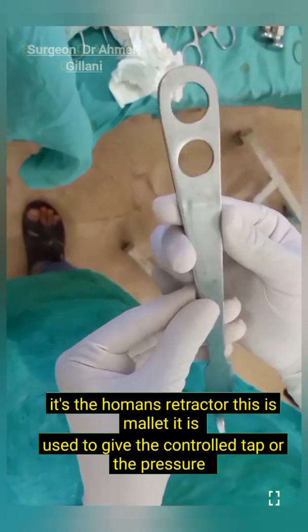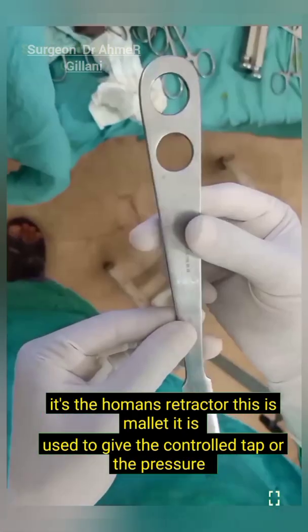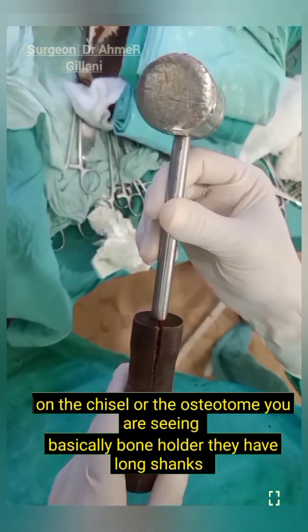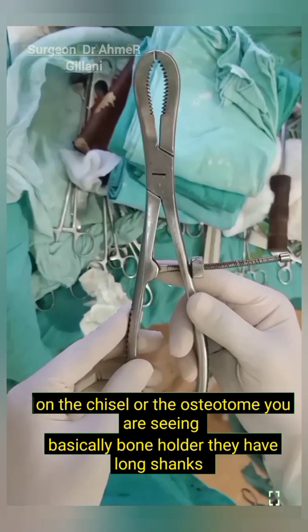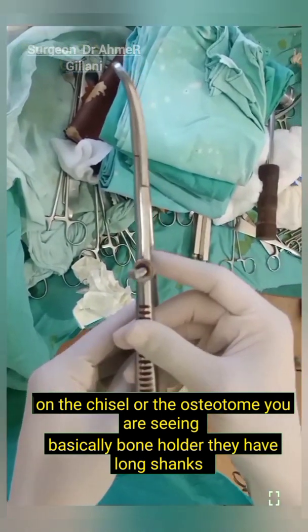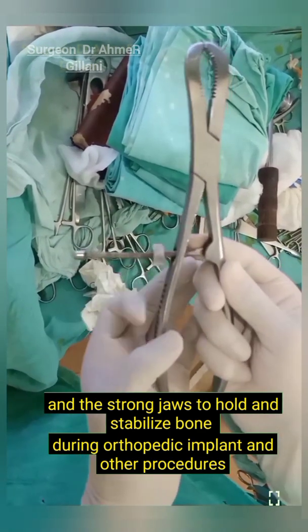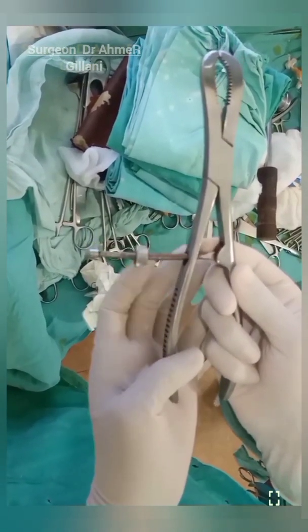This is the most commonly used instrument in orthopedics — the Homans retractor. This is the mallet. It is used to give controlled taps or pressure on the chisel or osteotome. Now you are seeing the bone holder. It has long shanks and strong jaws to hold and stabilize bone during orthopedic implant placement and other procedures.